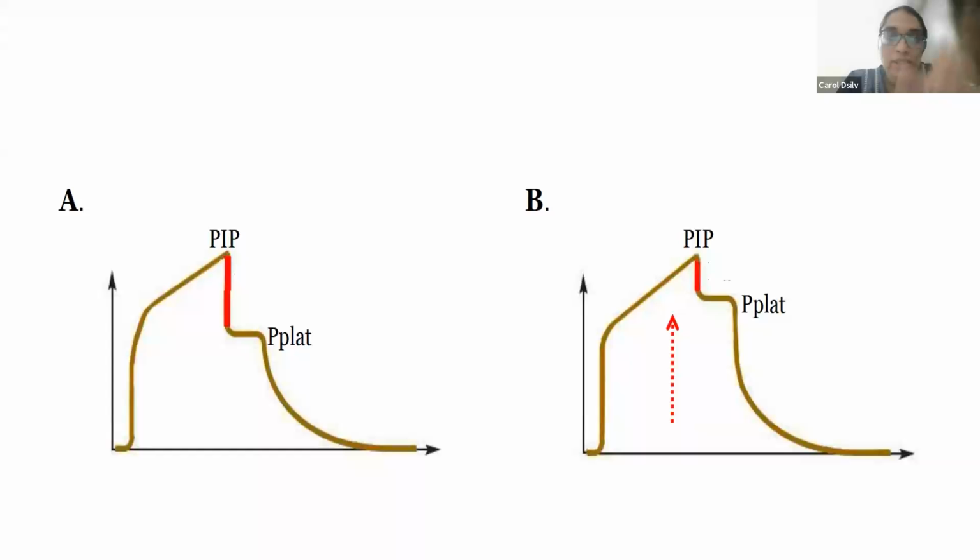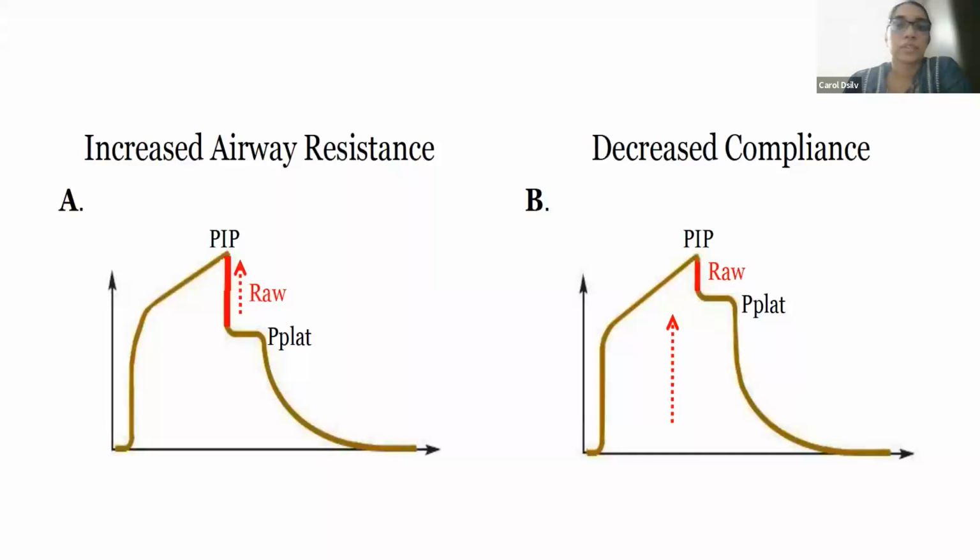If you imagine the lung as a straw and a balloon, anything to do with the straw, the straw is nothing but your trachea and your airways, endotracheal tube, that is what's going to cause an increase in the resistance. Anything to do with the balloon portion, that's basically at the level of your lungs or alveoli, so that is going to cause a change in your elastance or your compliance. It could be ARDS, pneumothorax, the examples that you have said. Perfect. All right. So this is a very important concept. I don't want you all to mug it. You all should remember this.